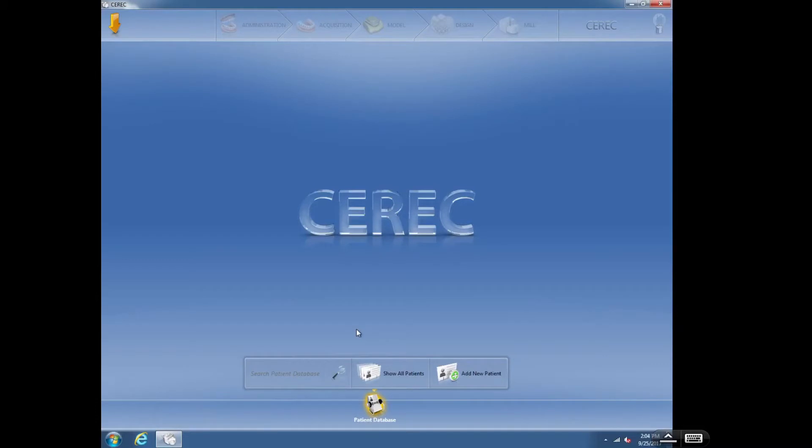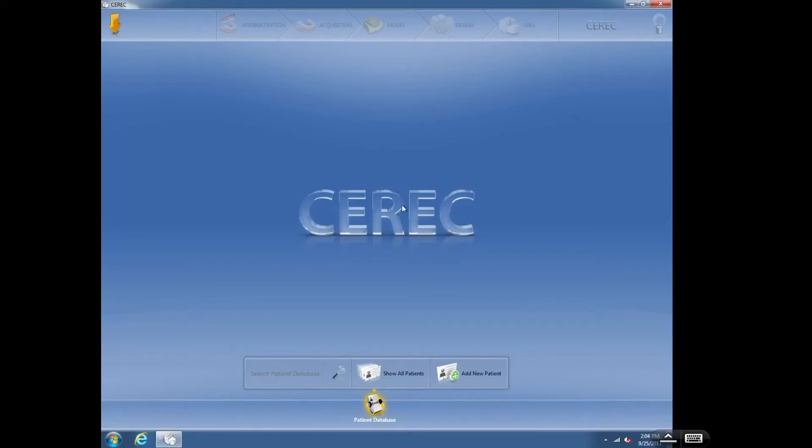This is software version 4.3. As you can see, I've opened the software up and we have the main landing page here. A couple of things I'm going to point out on this main screen. You can see it's not maximized. You can see the top bar and the bottom bar down here.